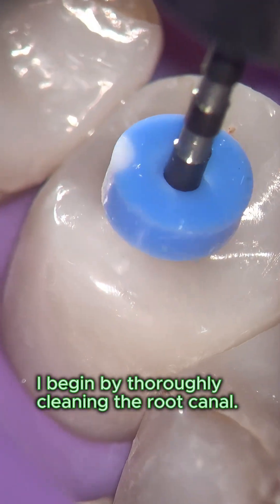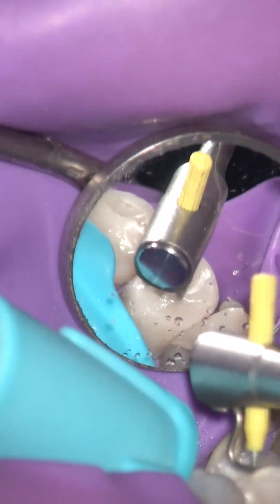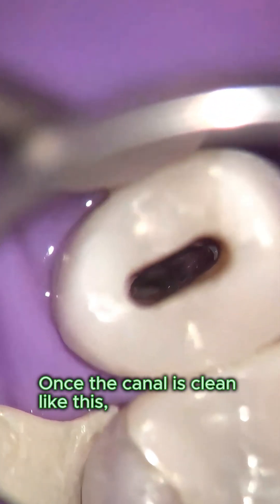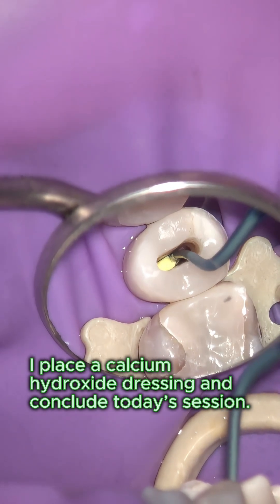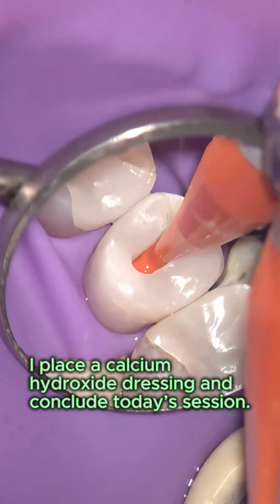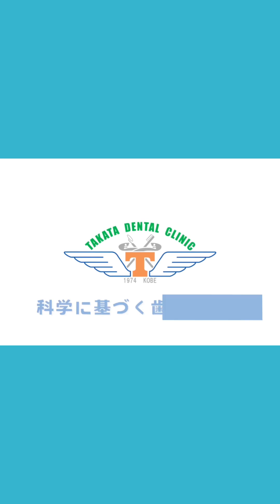I begin by thoroughly cleaning the root canal. Once the canal is clean, I place a calcium hydroxide dressing and conclude today's session. Science-based dental care — Takata Dental Clinic.